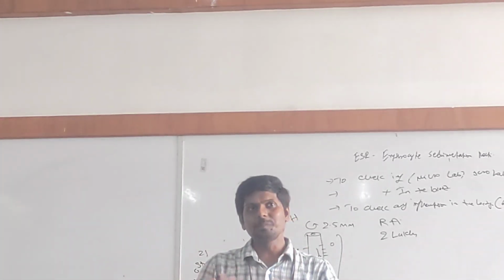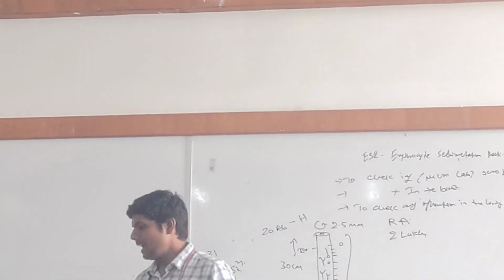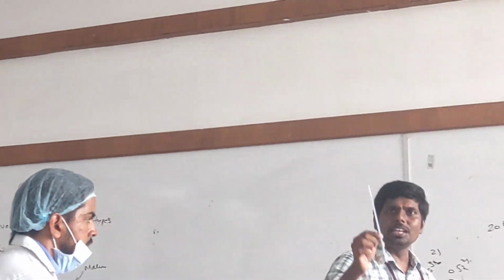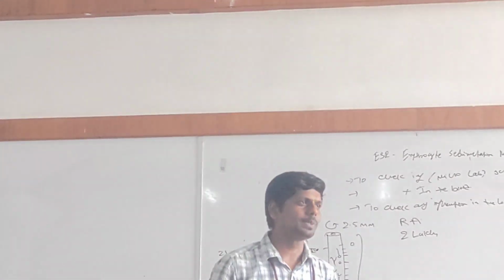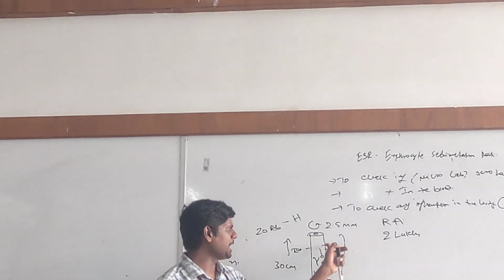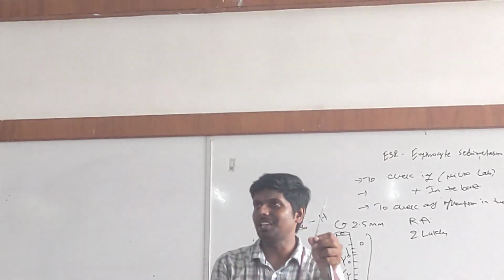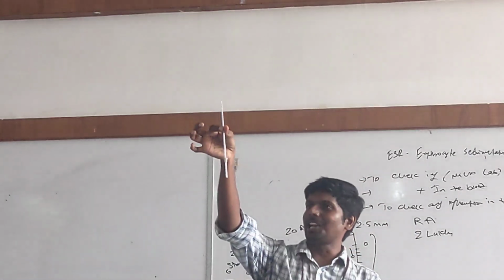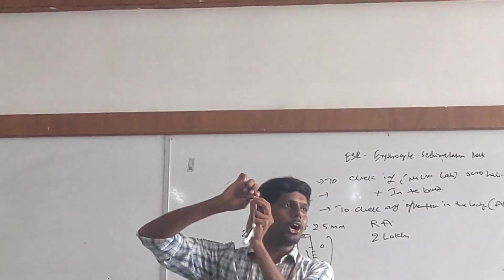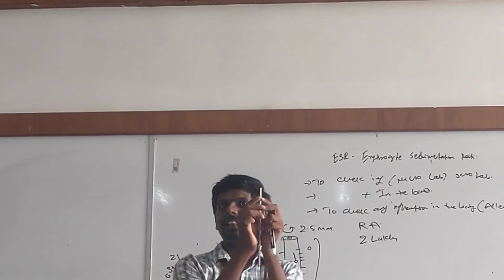So mouth pipetting has been nullified. Today in labs we are not doing any mouth pipetting, and we came up with a very nice solution. We came up with disposable ESR tubes. Ideally the blood should be taken up to the 0 mark, right? So what we did was reverse engineering. So this is an ESR tube. There is a 0 mark at the top, and there is a stopper inside this.